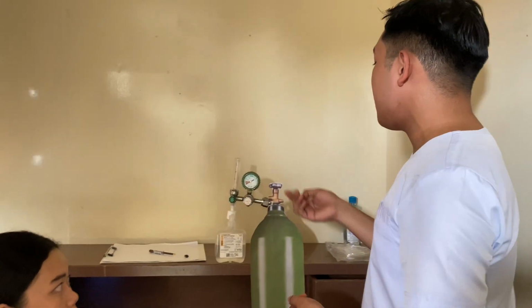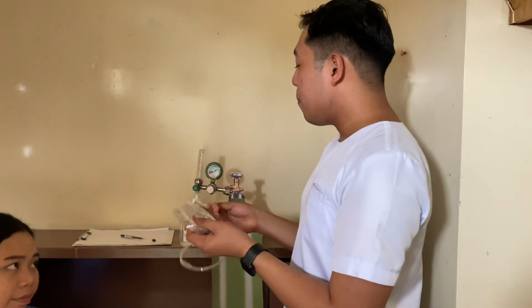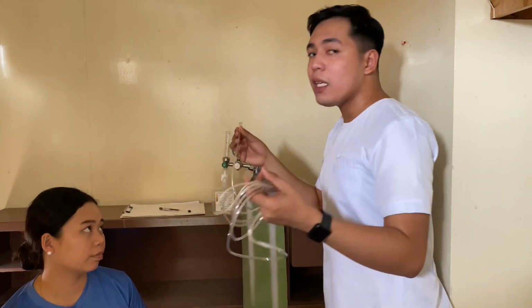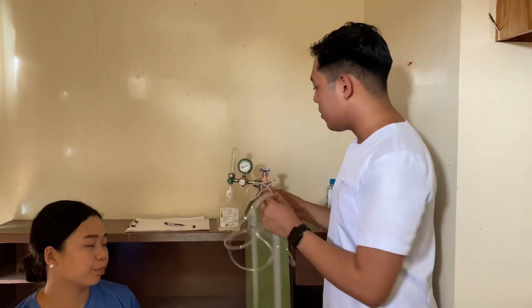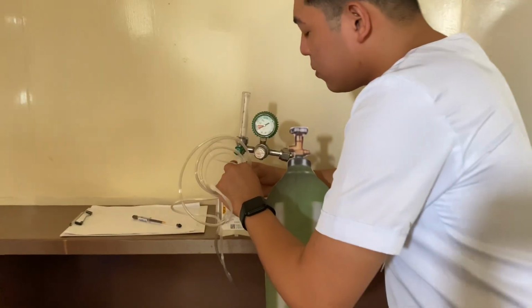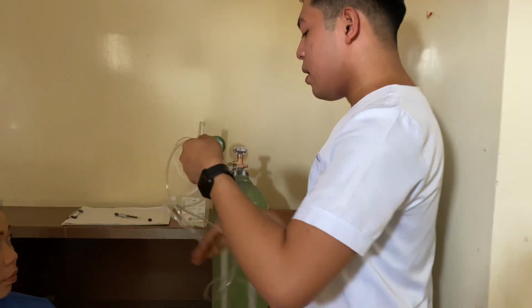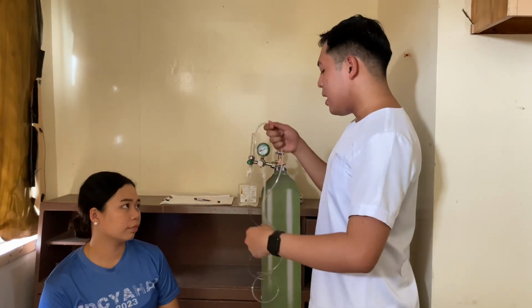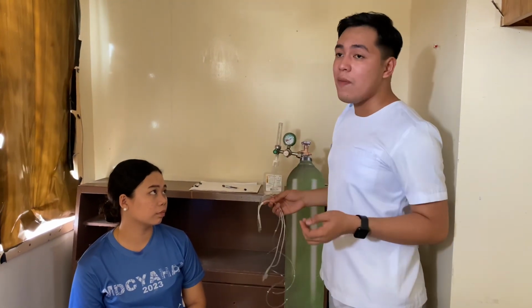After we turn on the regulator, of course we need to attach the nasal cannula to the humidifier bottle. But before that, I would like to explain that the purpose of our humidifier bottle is to avoid dryness or irritation of the mucous membrane. After we attach the nasal cannula to the humidifier bottle, the next thing we need to do is set the flow rate to the prescribed level.